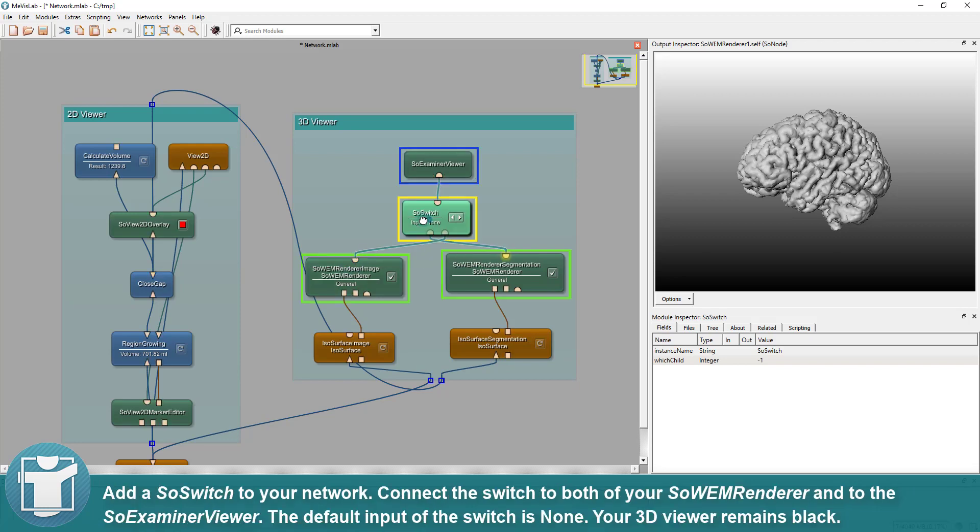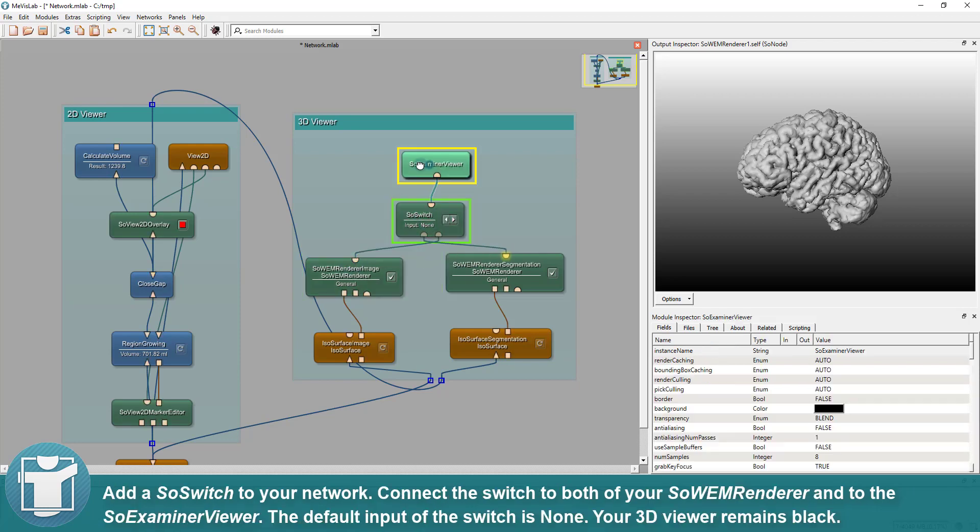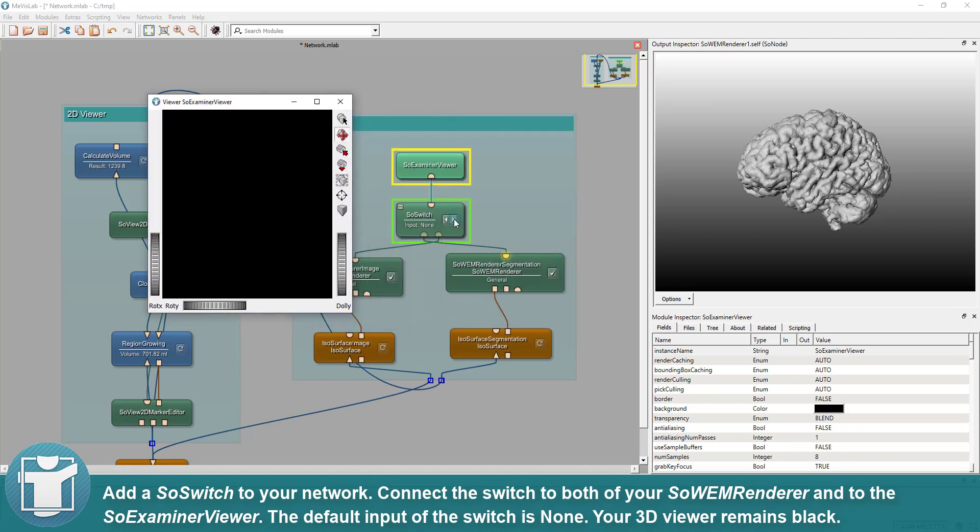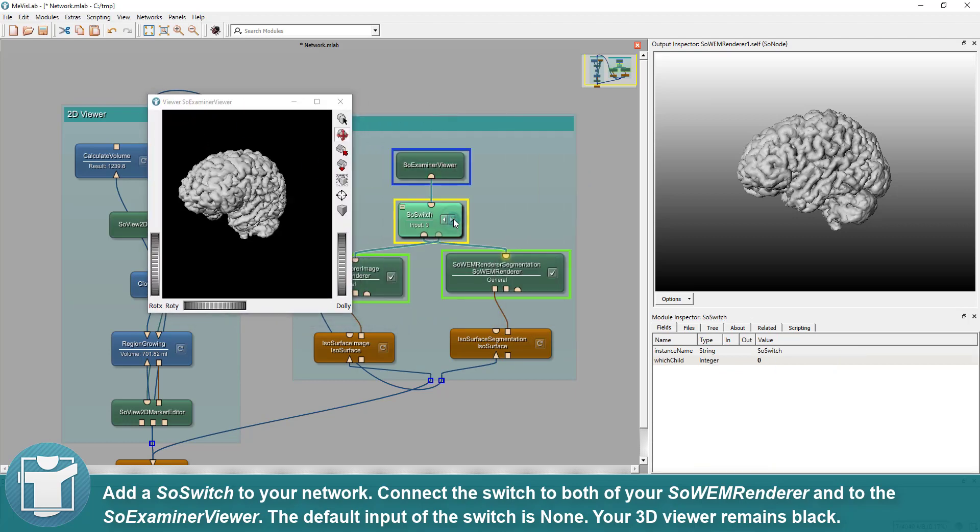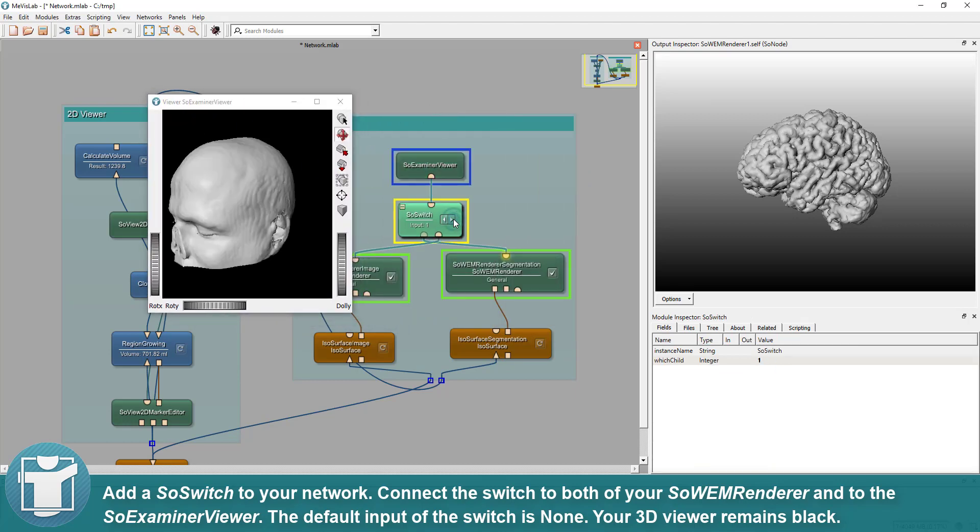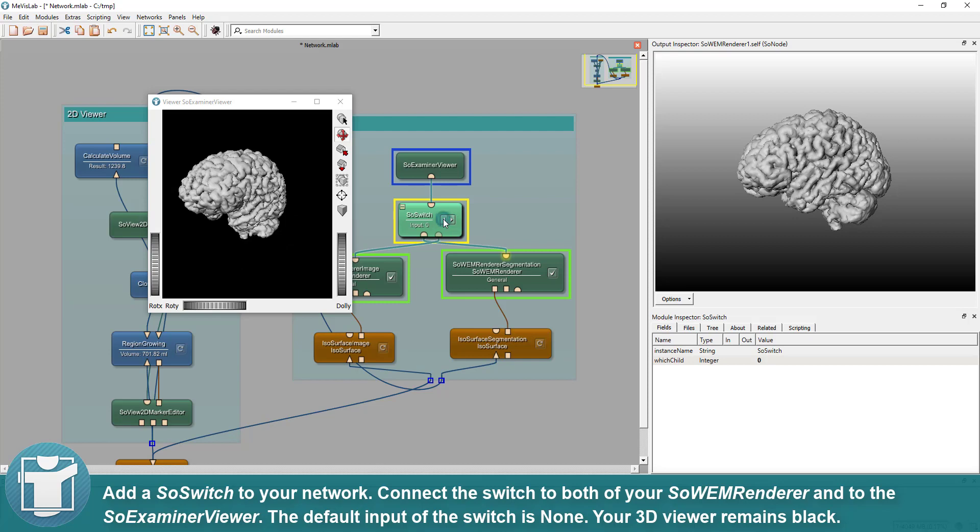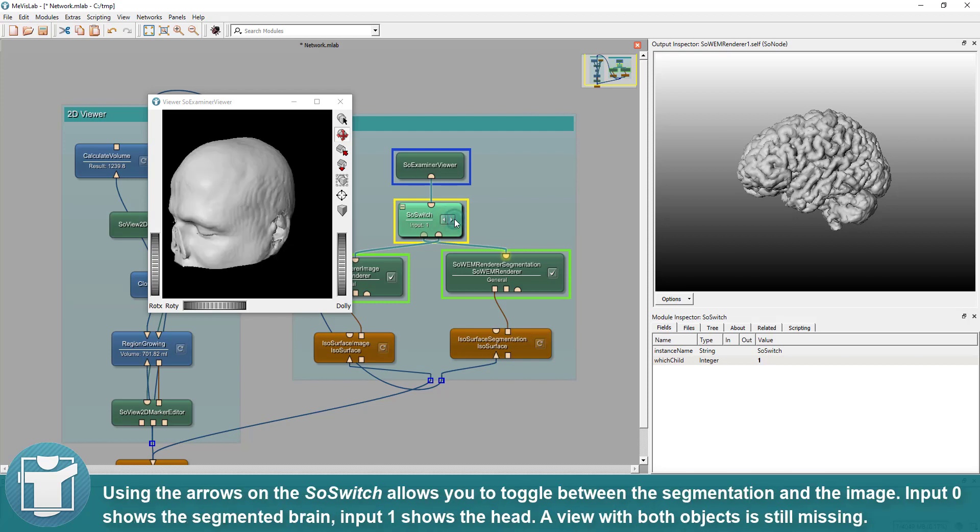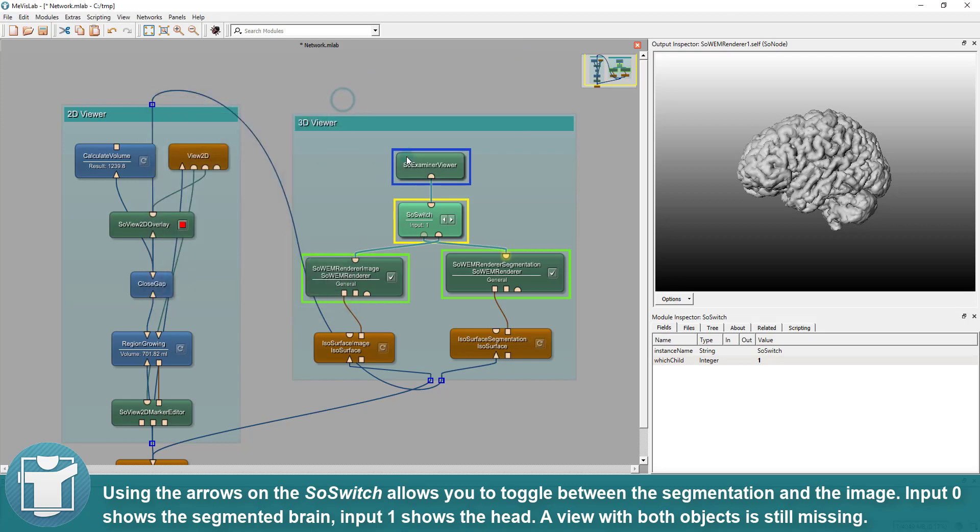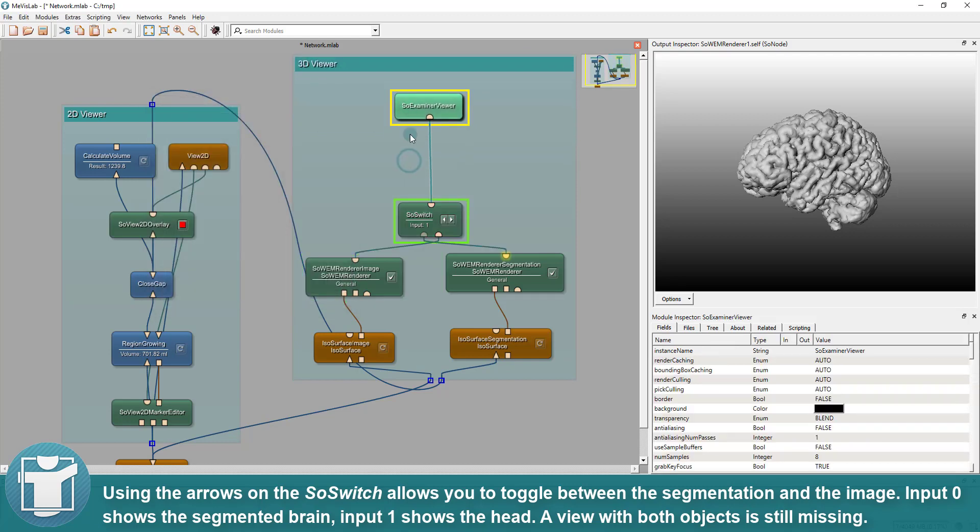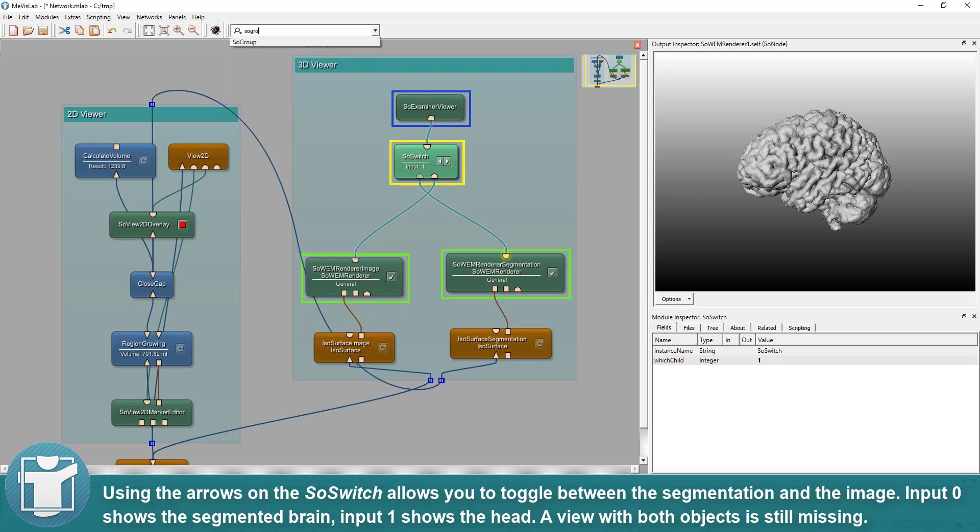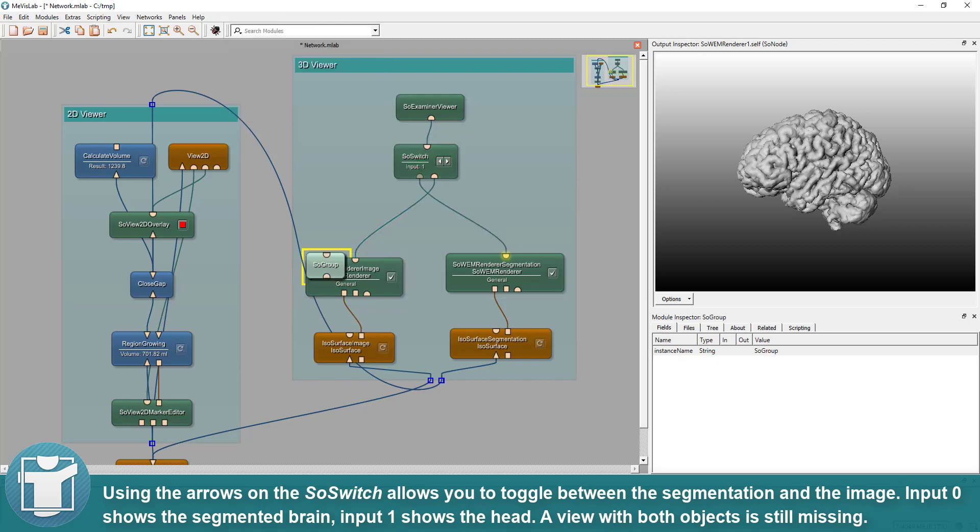Add a SoSwitch to your network. Connect the switch to both of your SoWEM renderers and to the SoExaminer viewer. The default input of the switch is none. Your 3D viewer remains black. Using the arrows on the SoSwitch allows you to toggle between the segmentation and the image. Input 0 shows the segmented brain, input 1 shows the head. You are now able to toggle between them.